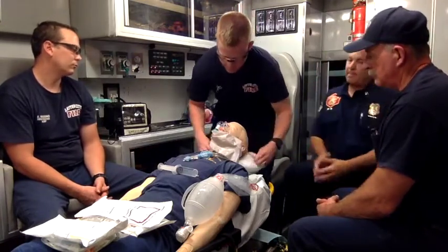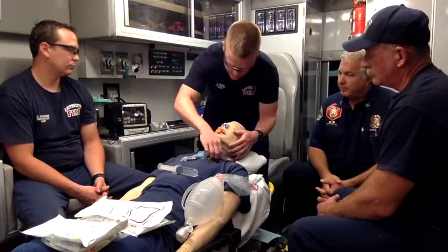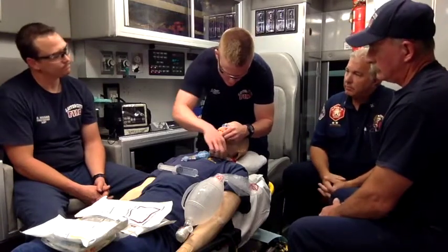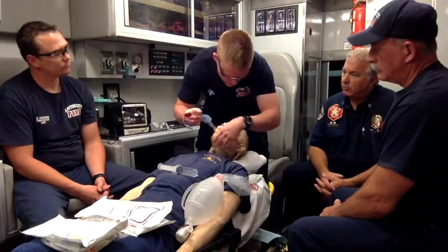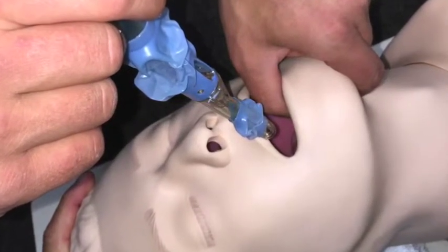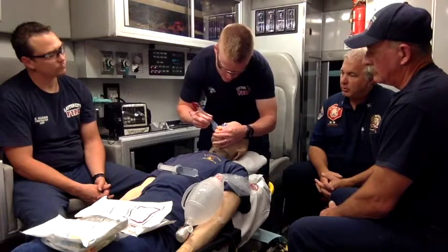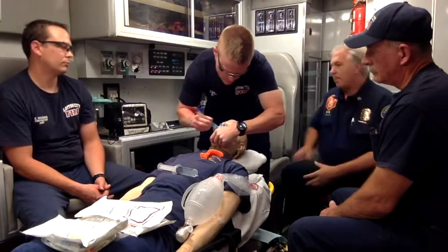Well, we're going to take this off, and there's multiple ways that we can do it. Okay, tell us. Biggest obstruction is the tongue, dropping down, we're not going to replace it. If he's already got the OPA placed, we can go off the side of that, or if we're having a hard time getting it through, then we can pull it out, pull the tongue back, and then drop that tube. Okay. On our King Airways we have the blue line. When we go to insert it, we want it to this corner of the mouth. Good. And with him, we may not be able to go with the OPA. Okay. So we'll pull the tongue, corner of the mouth.